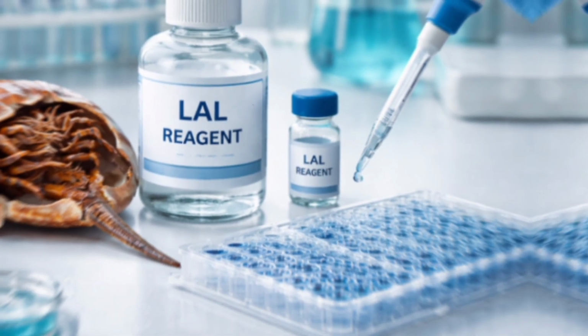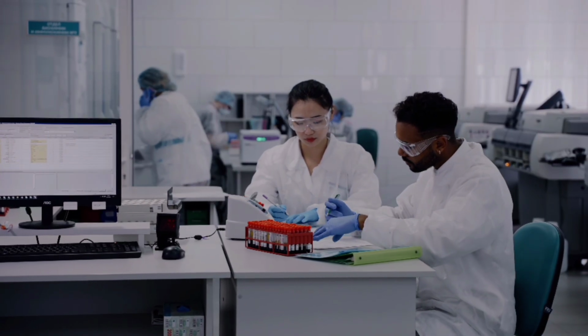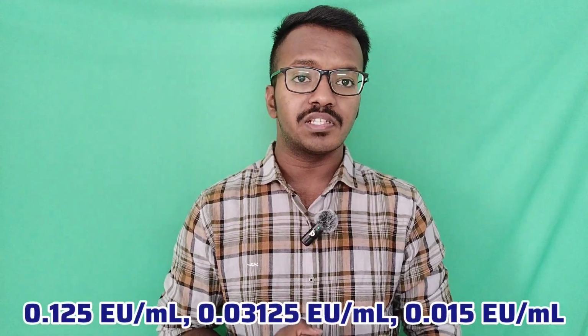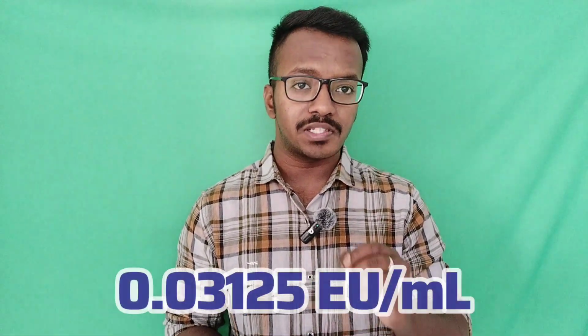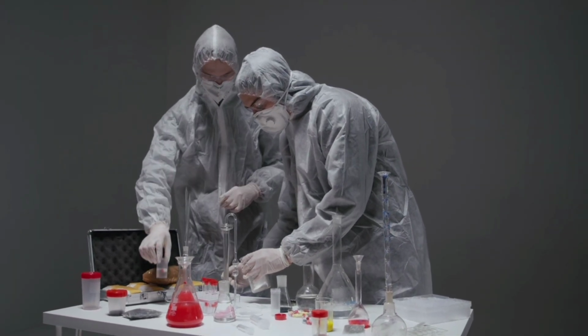Lysate is a biological enzyme which is used to detect endotoxin from the sample. Biomedical companies manufacture this lysate with different sensitivities like 0.125, 0.03125 and 0.015, etc. Lysate sensitivity is the concentration of endotoxin that the lysate can detect from the sample. For example, if I have a lysate with sensitivity of 0.03125, it means that lysate can detect endotoxin up to 0.03 EU per ml. Below the level of 0.03 EU per ml of endotoxin in this product cannot be detected from this lysate.